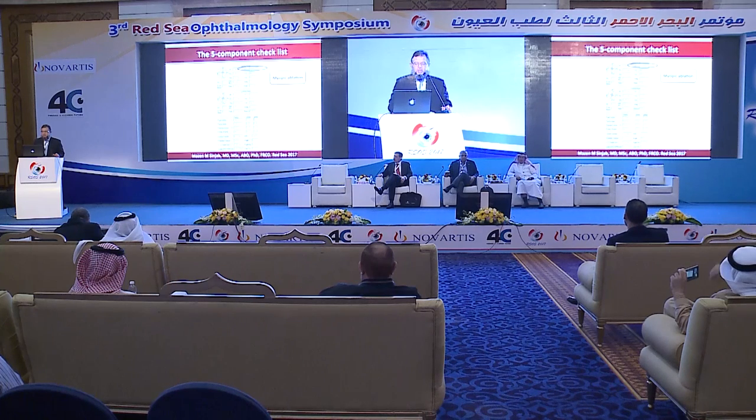The K readings are very important in the calculation before proceeding. K1, which is the flat K, is important for myopic ablation. And K max, the maximum K reading, is very important in hyperopic ablation. And I measure the astigmatism depending on the total corneal refractive power map using the 5 millimeter zone centered with the pupil center.